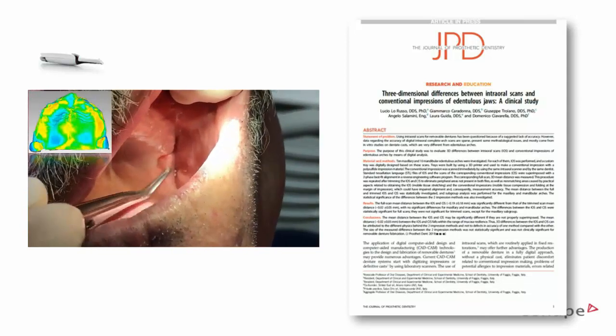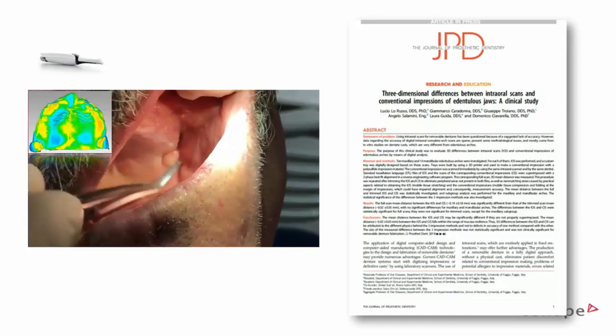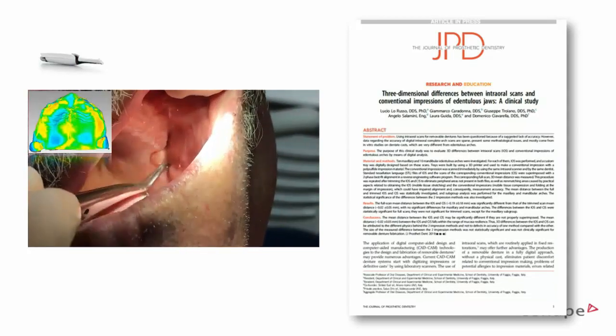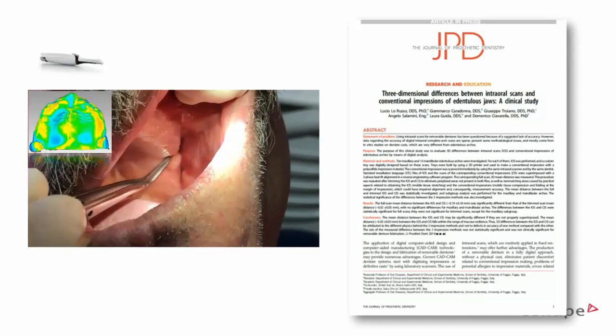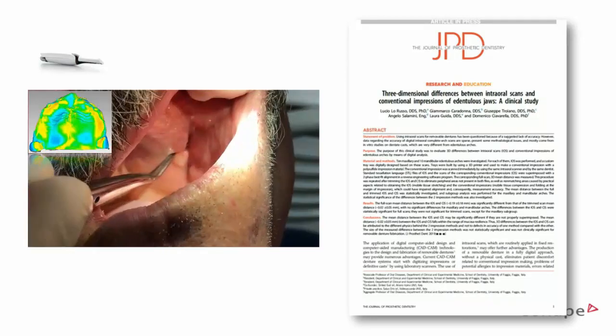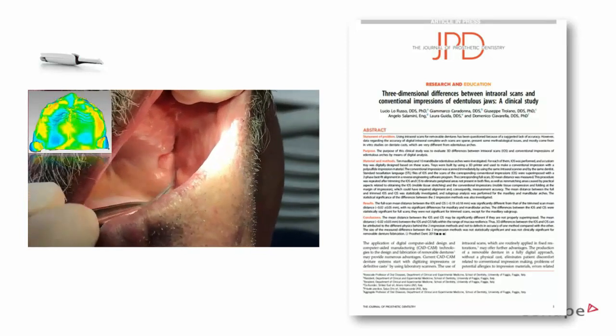Also a free-ended partial. I have not heard any problems with free-ended partials. So generally, partials are working in our opinion, and the framework is fitting great. We haven't heard anything else. Again, it depends. The biggest problem with partials is how you cast the framework if you do it out of wax, and this is the real challenge.